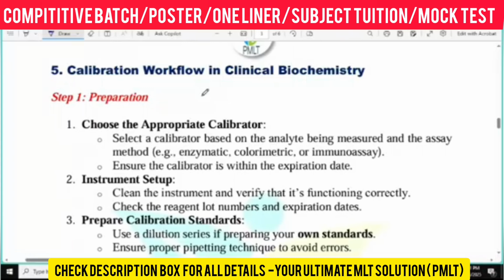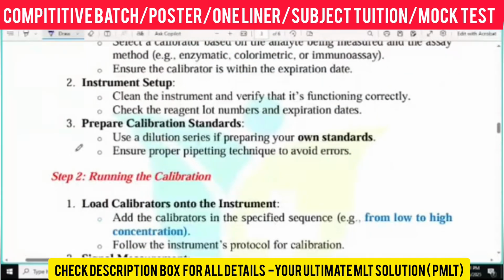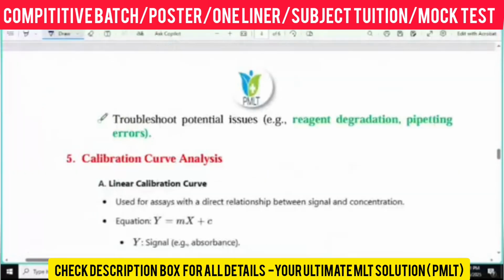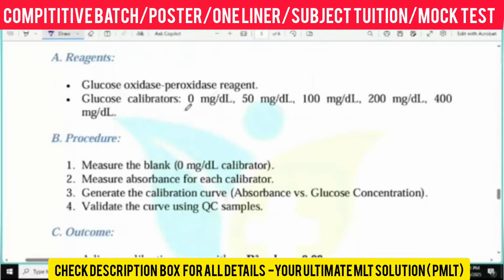Calibration workflow in our biochemistry laboratory: step one is preparation; secondly you have to run the calibration; thirdly you have to verify it; after that you have to generate the calibration curve.